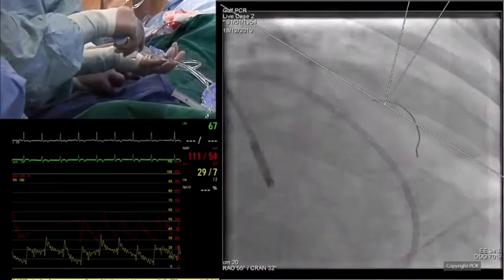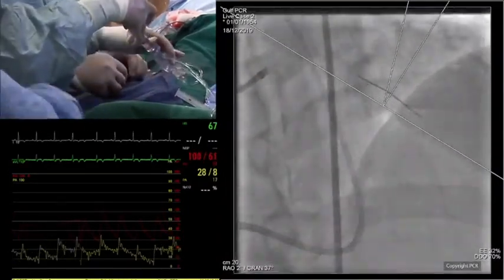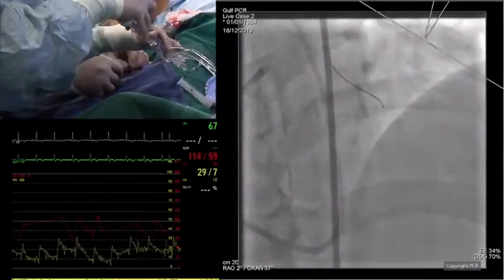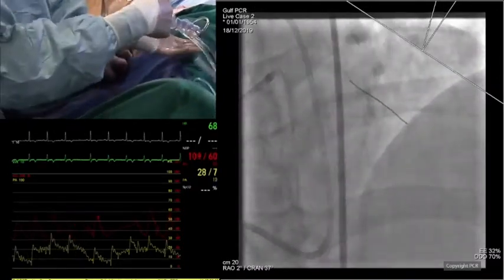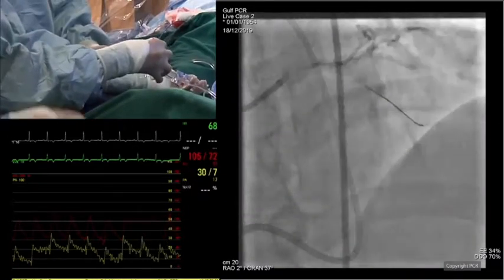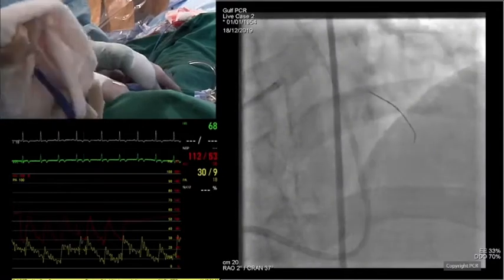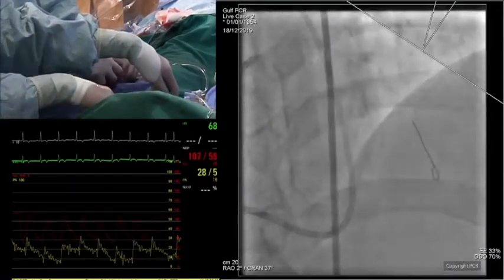And that's the reason they are using a guide liner. It is a very simple step in cases where you have these difficulties in advancing the OCT. It's not something exceptional. You can see that they do this regularly and that they know that circumventing these small problems is going to bring them a lot of information. It was beautiful in the first case, and in this case, how they use the information to plan the procedure.